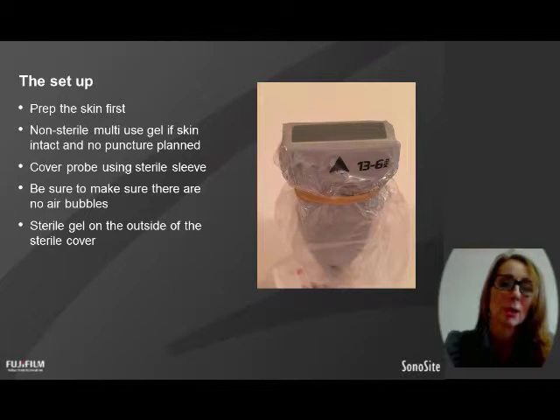I make sure there are no air bubbles. This is another common error, that you don't put that elastic band nice and tight, and make sure that there are no air bubbles in the gel, because with air bubbles in the gel, the sound waves can't travel through, and that will just make your image not correct.